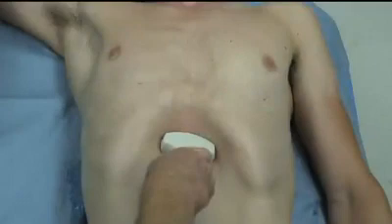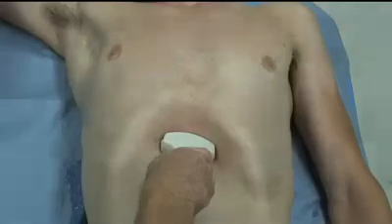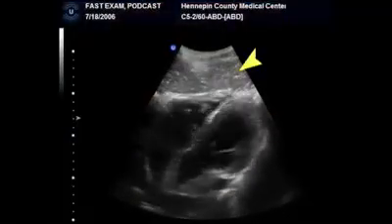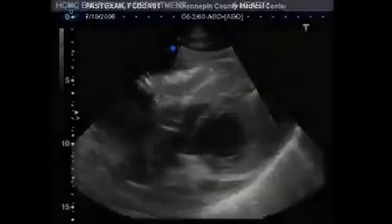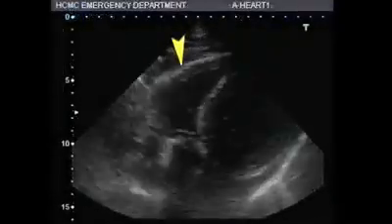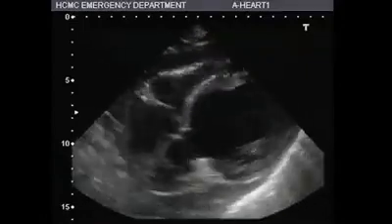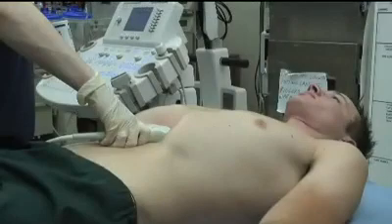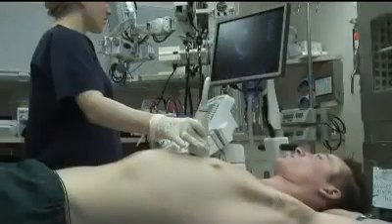The cardiac view may be valuable in blunt trauma but is critical in penetrating trauma. The ultrasound probe is placed in the sub-xiphoid position transversely to evaluate the heart for pericardial effusion. A normal view will visualize the liver, diaphragm, pericardial space, and right ventricle. A positive view will show an anechoic region, or black space, between the heart and liver. If you are unable to visualize the pericardium in the sub-xiphoid view, the probe should be moved to the parasternal position.